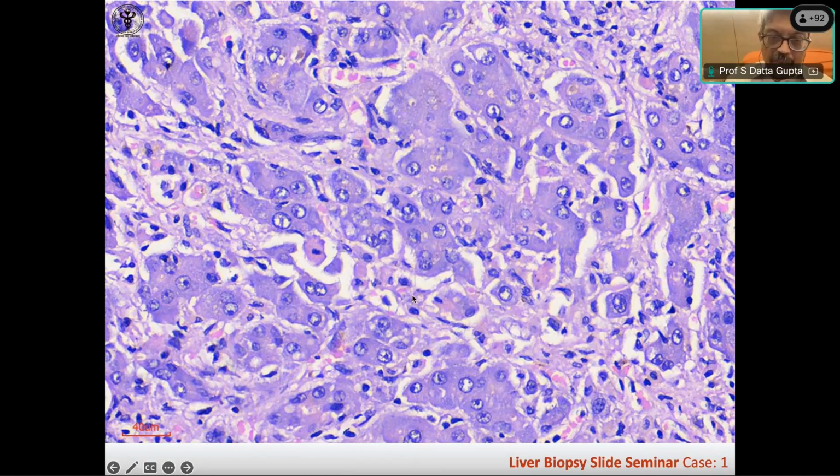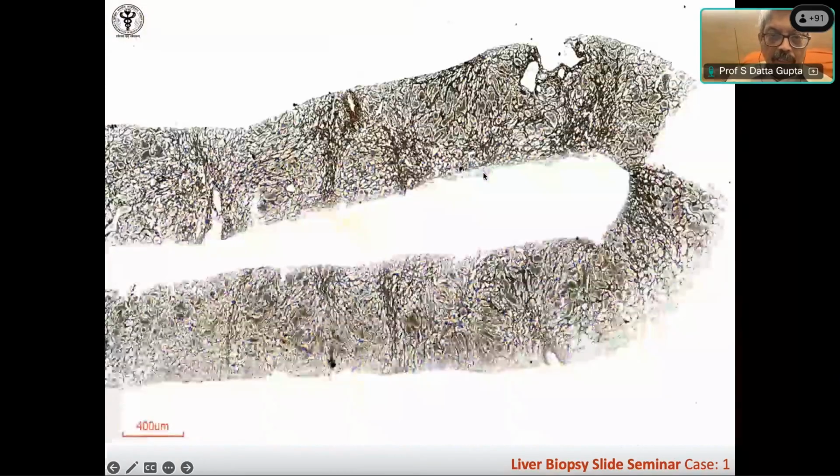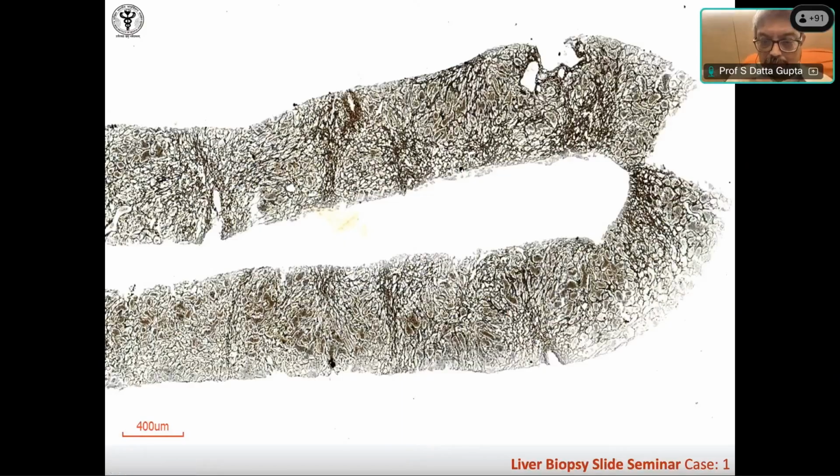Look here, right? Yeah, this might be that. Same thing here. See this? Blood vessels here. This is unlikely to be fibrosis, but anyway, one has to be careful. Fibrosis here and this. There's a portal tract here, there's a portal tract here, and in between everything has gone. Here the same thing. And the reticulin looks as if there's fibrosis here.